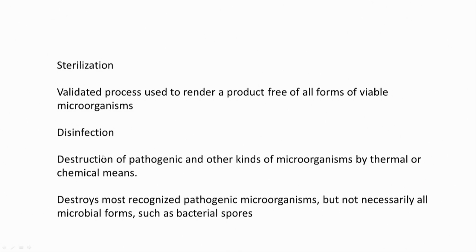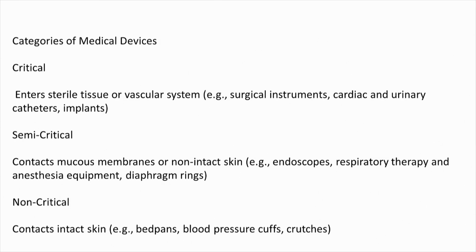Disinfection, on the other hand, is destruction of pathogenic and other kinds of microorganisms by thermal or chemical means. It destroys most recognized pathogenic microorganisms, but not necessarily all microbial forms like spores, because spores may be able to last longer and withstand high temperature. So, it might kill many, but not completely. It depends upon the threshold, the lower limit.